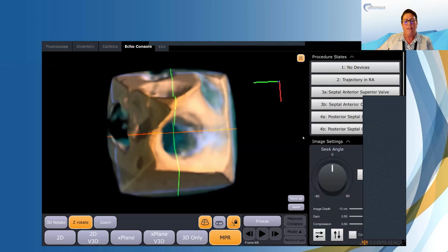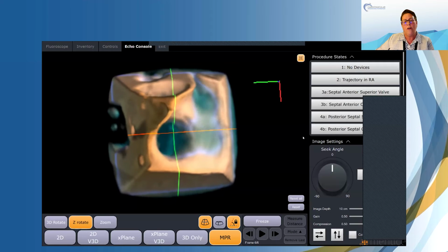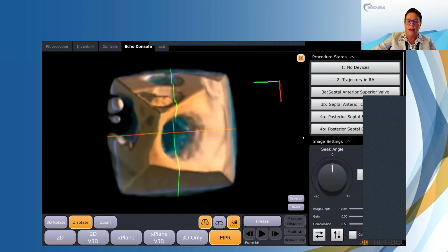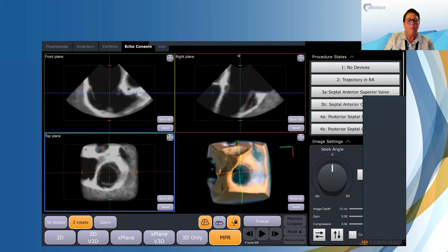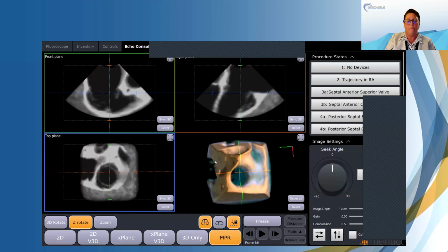So let's see if I could get on this AS commissure. I think I would like my volume to move. Here we go. To the right, just a hair. I overshot just a bit. All right. So let's get my lines back. So I can see in my green plane up here on the left, I have that kind of home view we had, and then I have a nice potential grasping view here.